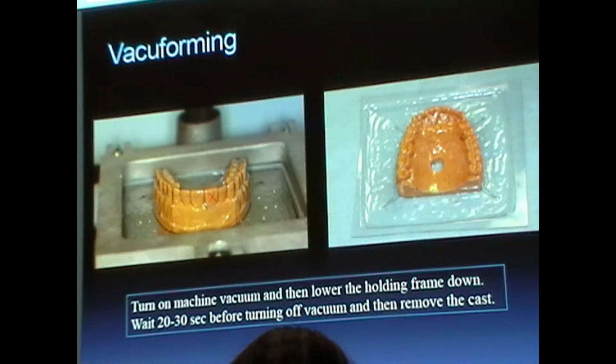So ultimately, you want a very nice integration all the way down. Don't be so concerned if you end up with seams, particularly at the corners of the arch, like in the canine region. That's just a factor of how long you let the material heat and slump and how well of a vacuum was formed. Okay? So if it does happen on a critical area, we're just going to keep going. Okay? So the crease won't be such an issue.